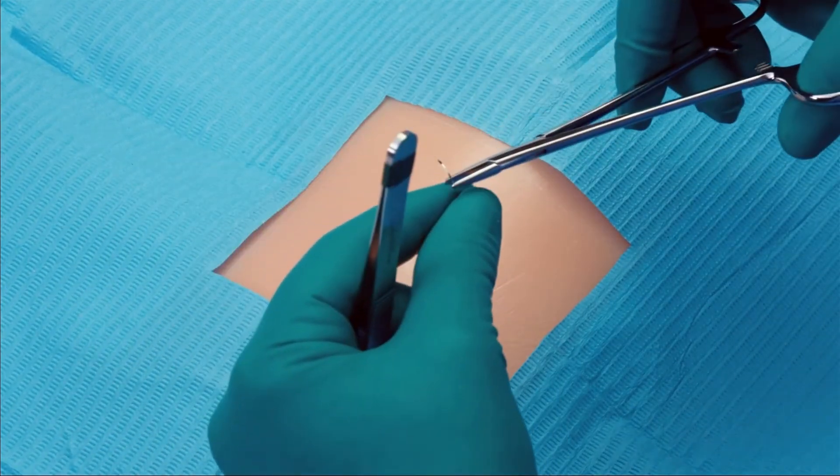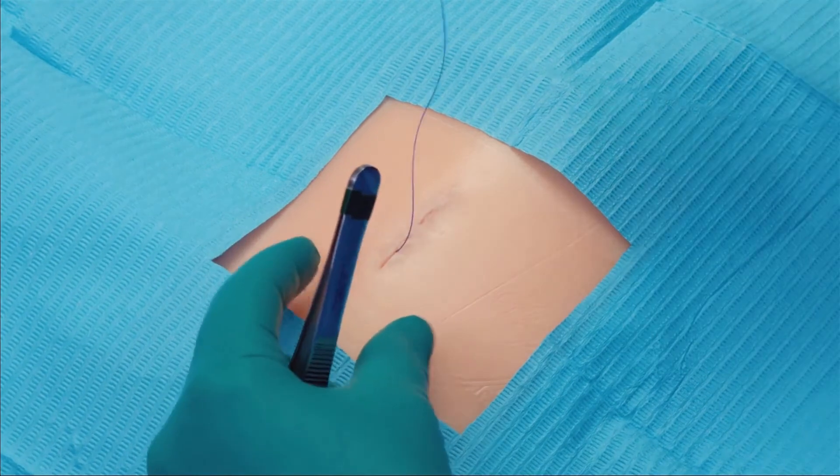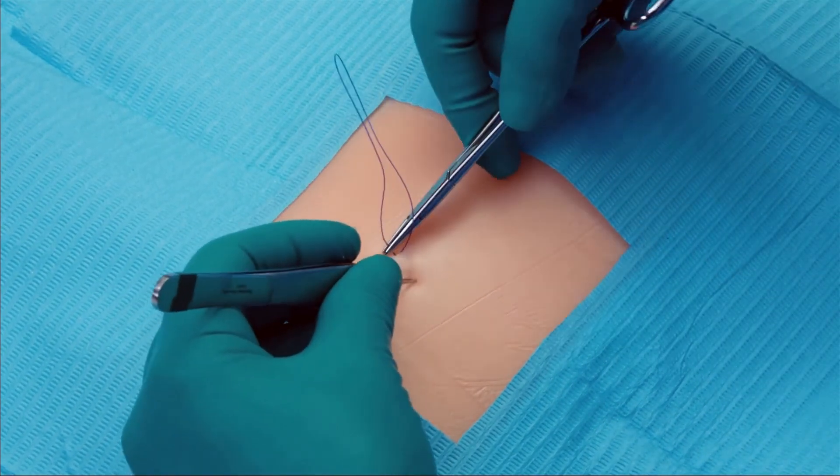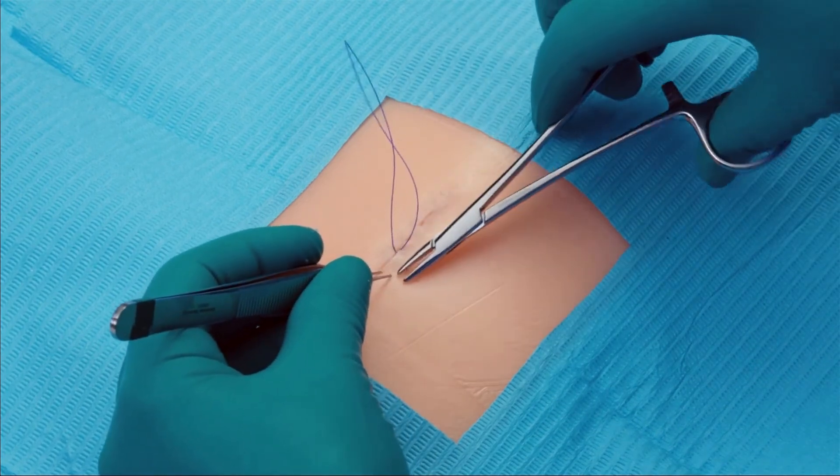Once the backstitch is complete, simply exit lateral to the incision, coming out of the superficial skin, and then cut flush.